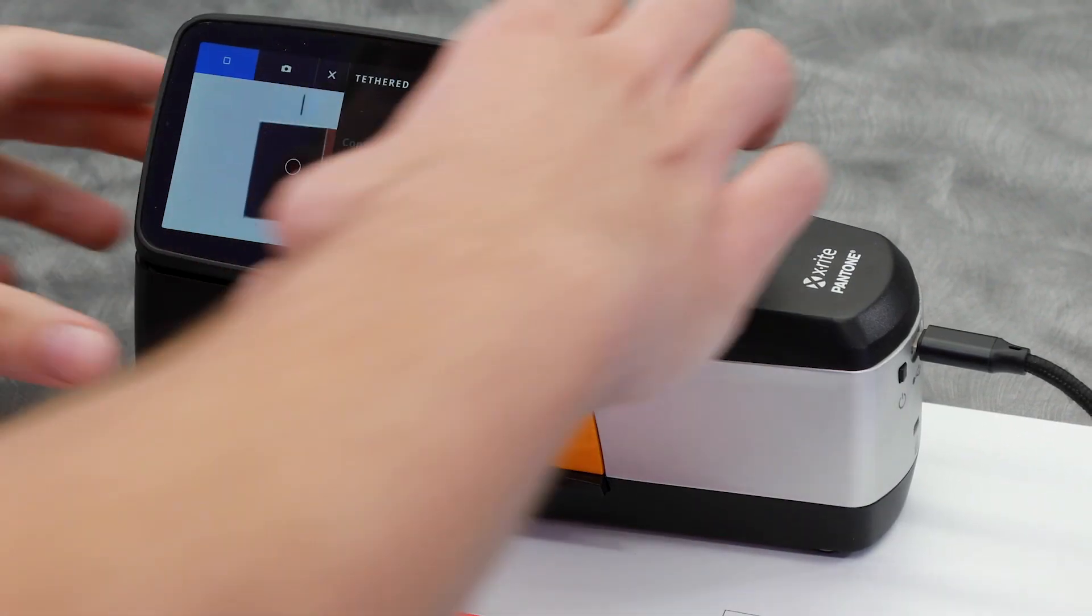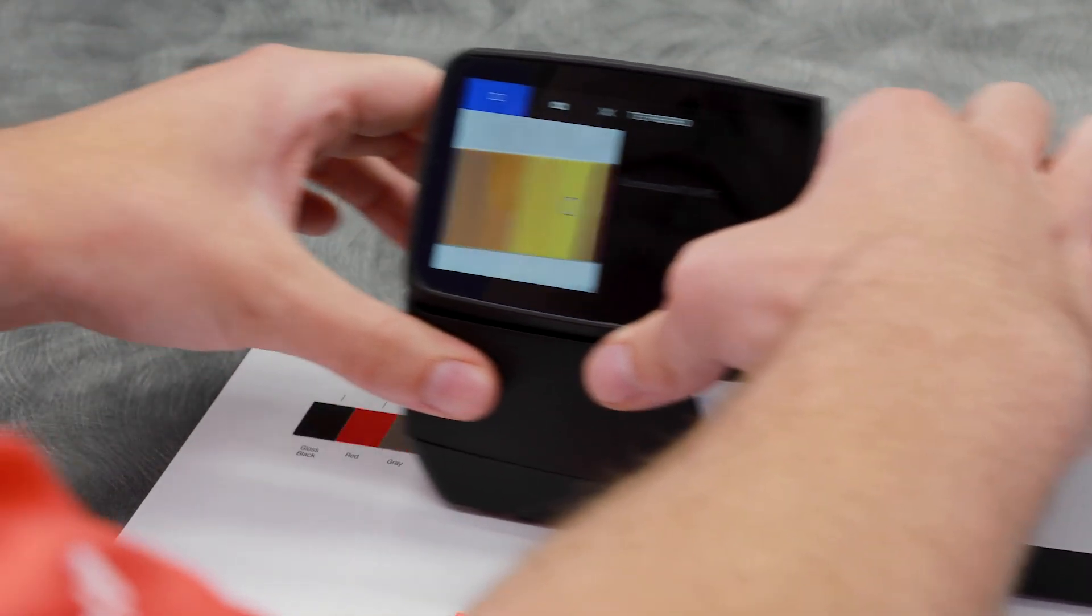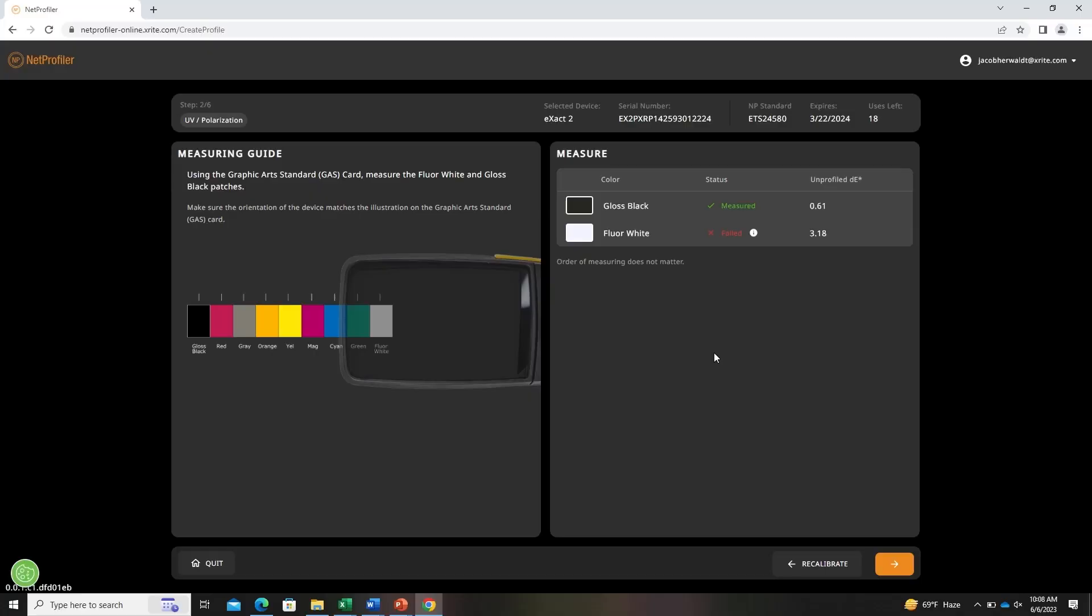Here I'm showing you what a failed measurement will look like on screen. You'll be prompted with tips on how to improve the measurement. Now we'll move on to the next step.